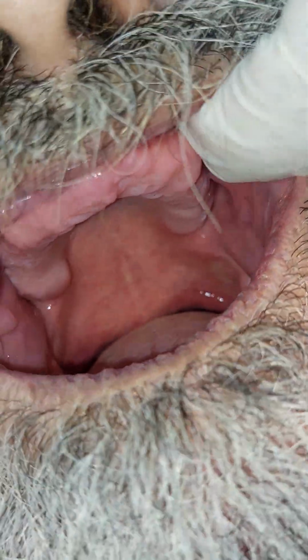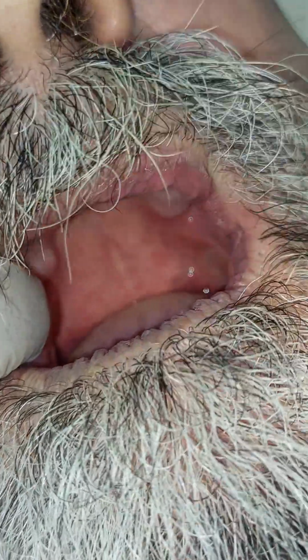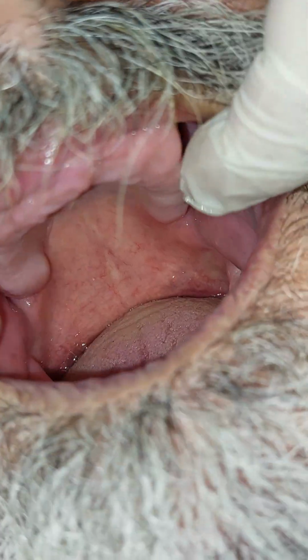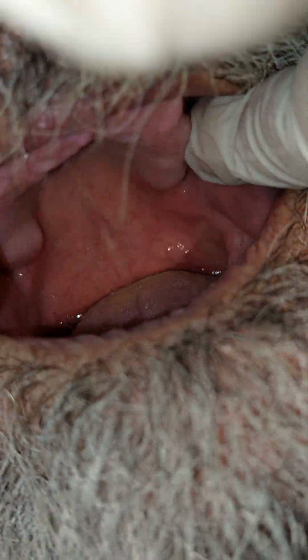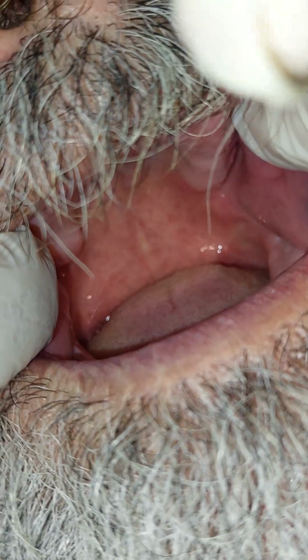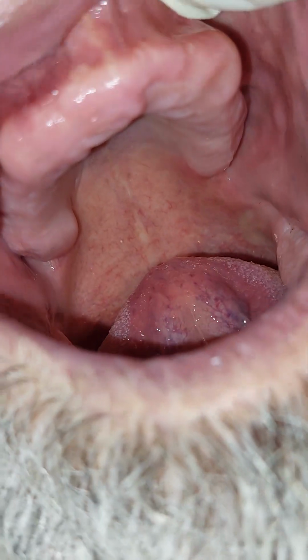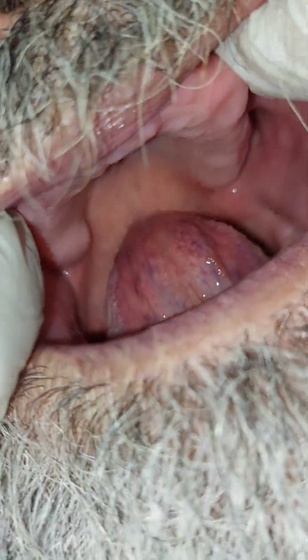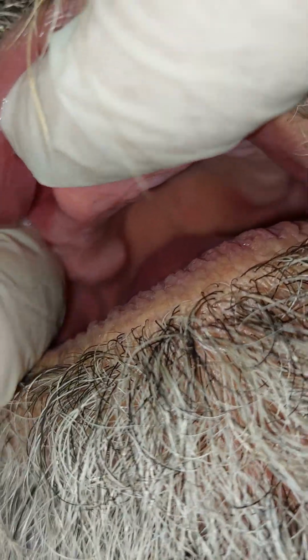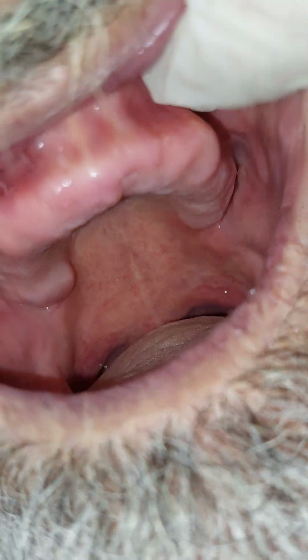are opposite to each other. I need to either relieve them by surgery, where I reduce, especially in the molar areas and around the tuberosity, or I relieve the undercuts, I block them on the casts and utilize only one side of the undercuts, not both sides. So I would relieve one side of the cast and let the denture use the other side of the undercuts. Or if they are so severe, I might relieve both sides, just leaving a very minimal undercut engagement with the denture.